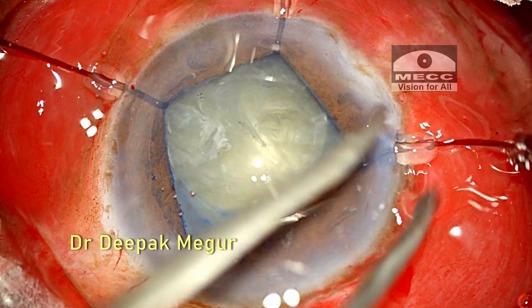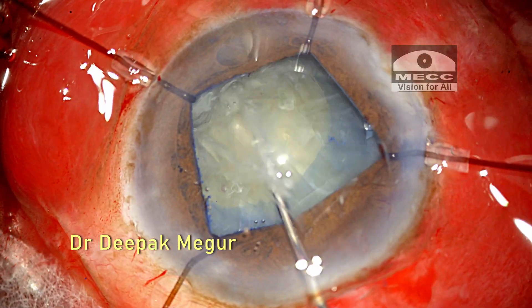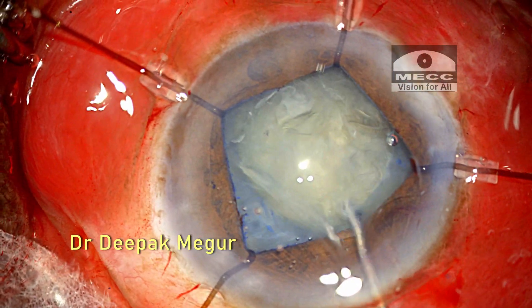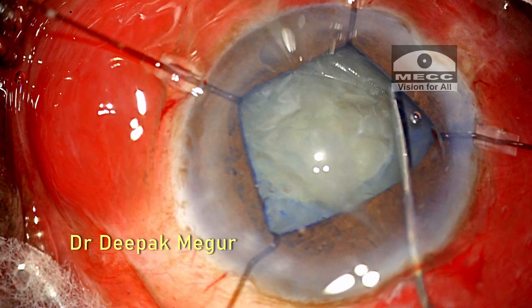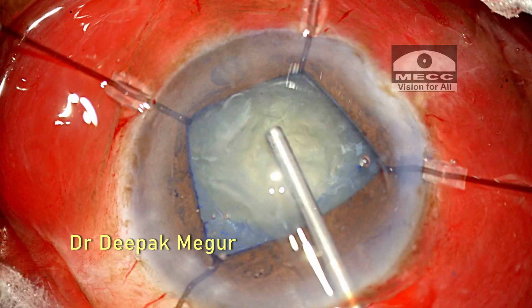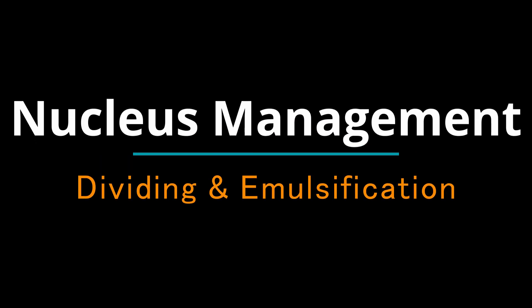The hook is reinstated to engage the pupillary margin. The important tip I'd like to share is not to delay the insertion of the CTR in such eyes with expected generalized zonular weakness. It provides an equatorial stretch to the capsular bag, thus stabilizing it significantly to withstand all the maneuvers during nucleus management.